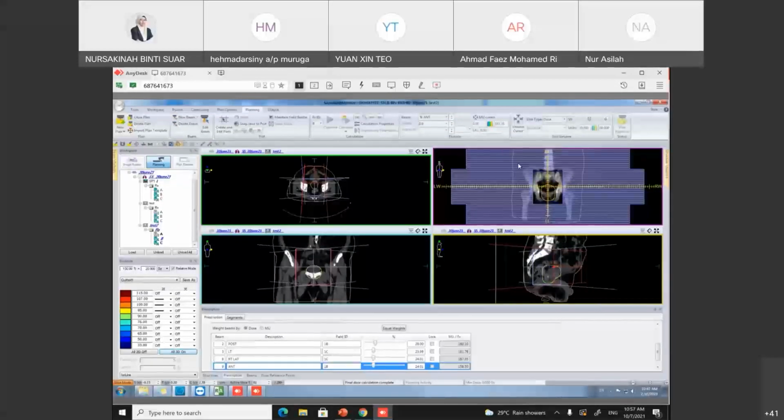So you need to listen carefully and mark down where the doctor wants to change it, because sometimes the doctor is just giving a verbal call remotely, like we are doing now. The doctor is very busy. He's not sitting in the radiotherapy center only, he is sitting at their clinic. So normally at our center they will just remote from their clinic to tell you.